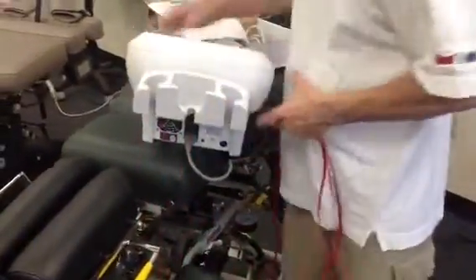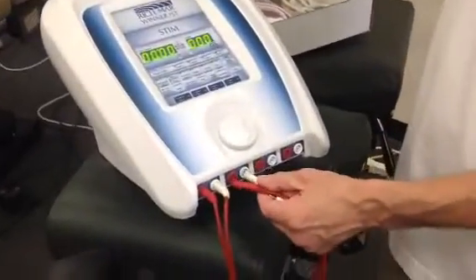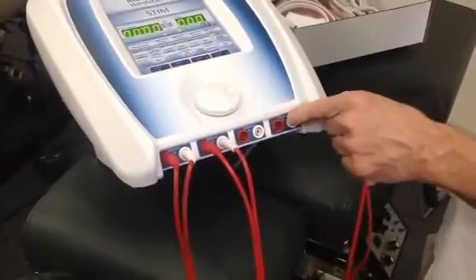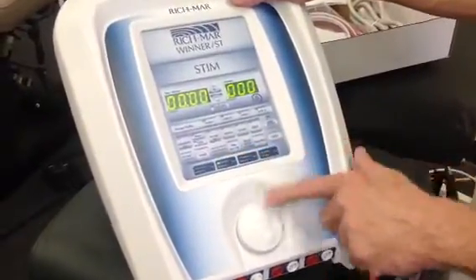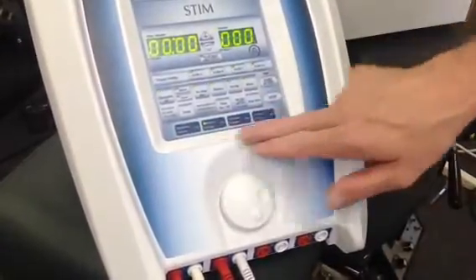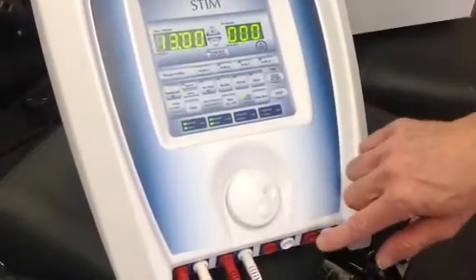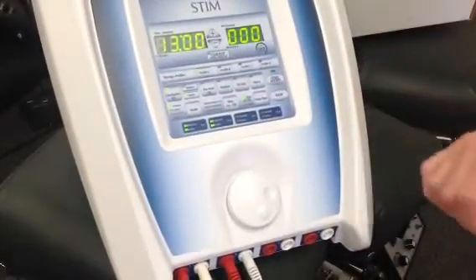We're going to turn the machine back around. Since it is a 4-channel machine, we're going to plug into channels. We have 1, 2, 3, and 4. There are your markers, and those relate to each one of the channels. These bottom 4 are actually buttons, no different than all of these are buttons as well. So you can choose to select a channel, or the machine will grab available channels from left to right.